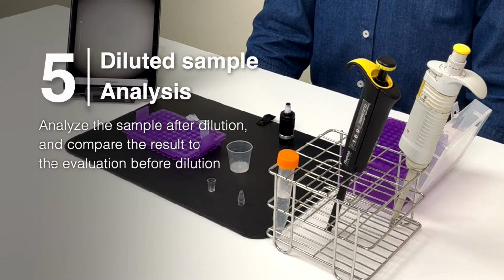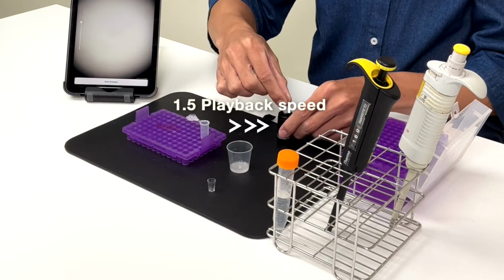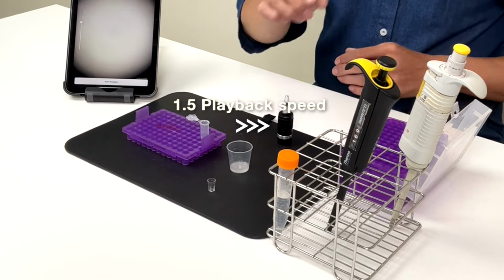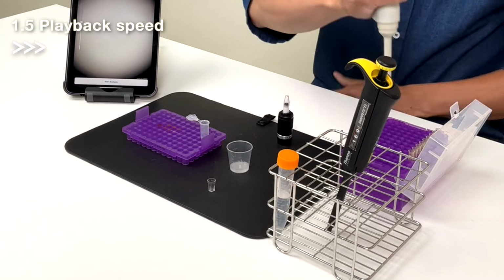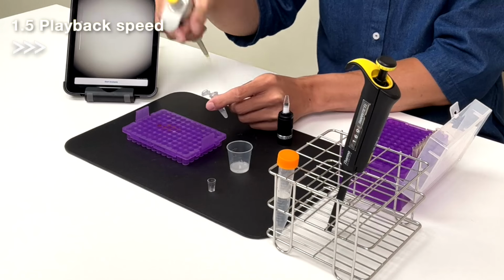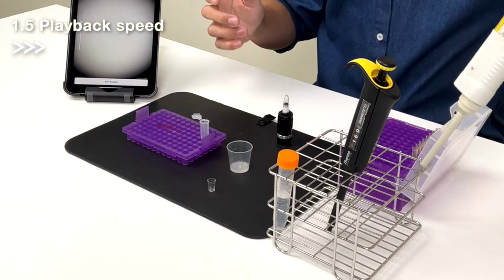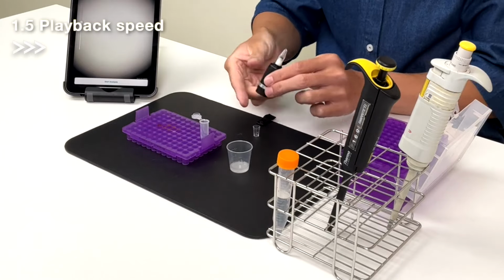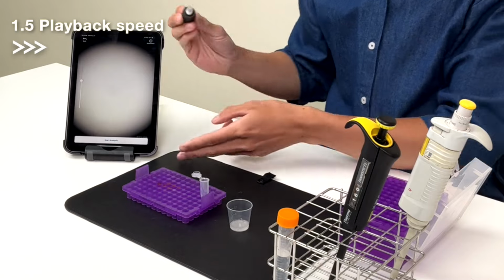Step 5. Diluted sample analysis. Next, analyze the diluted semen using iSperm. First, put the base chip on top of the sample collector. Adjust the pipette to 7.5 microliter, and place the tip. Then dispense the diluted sample on the base chip. Flip it over and press it into the cover chip until you hear a click sound. Turn on the light source and install the sample collector.